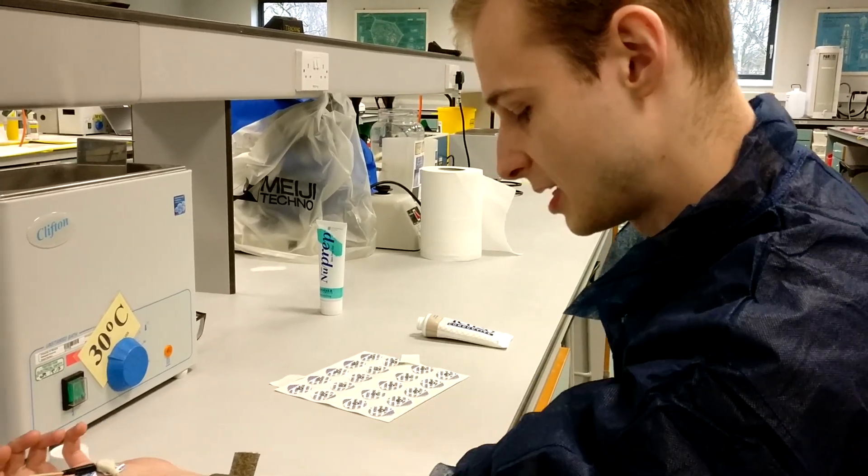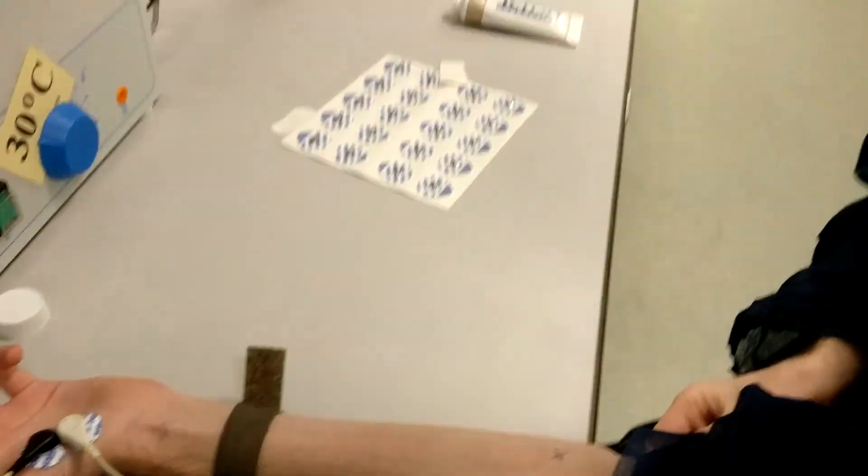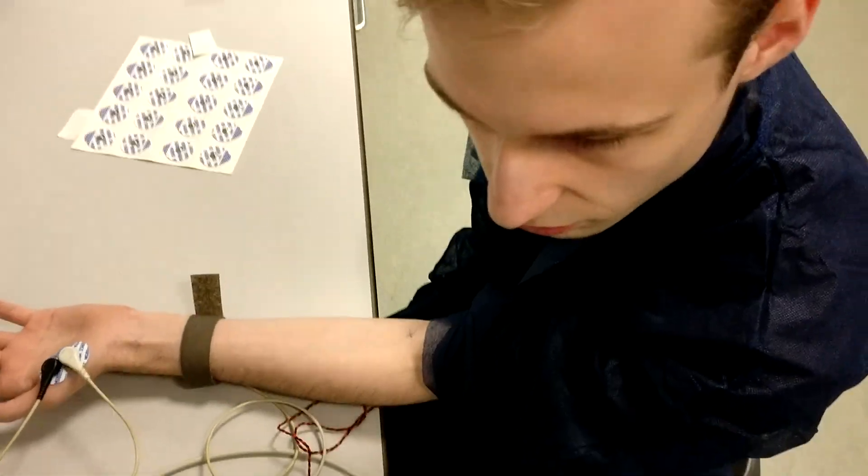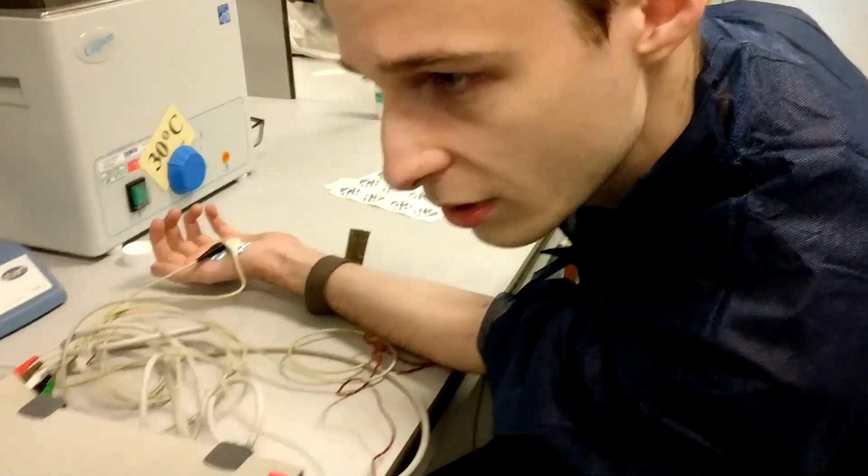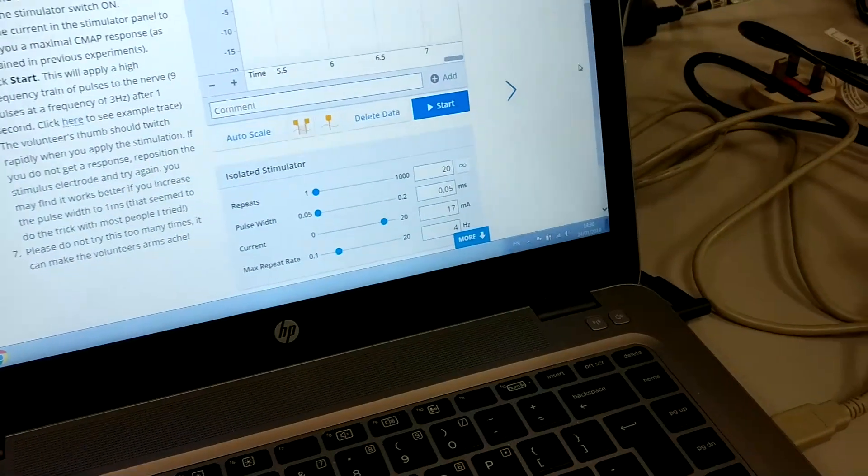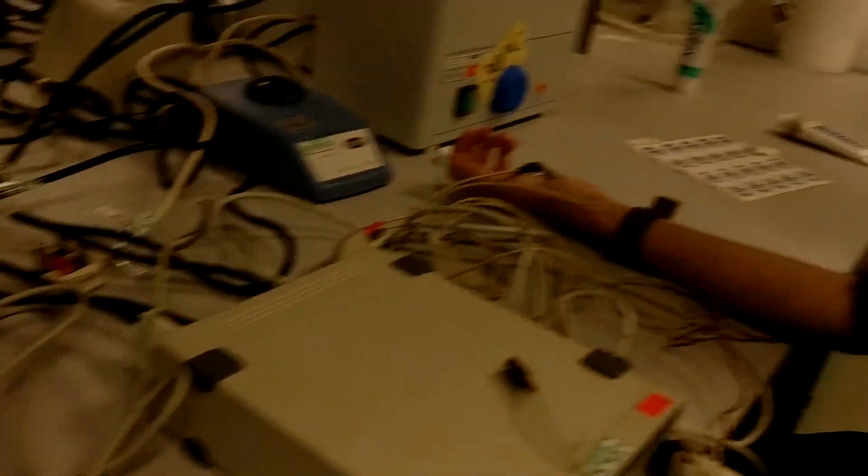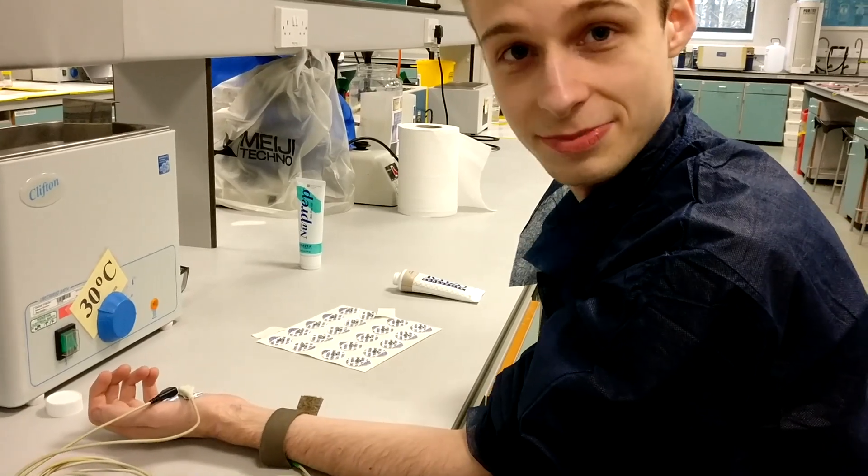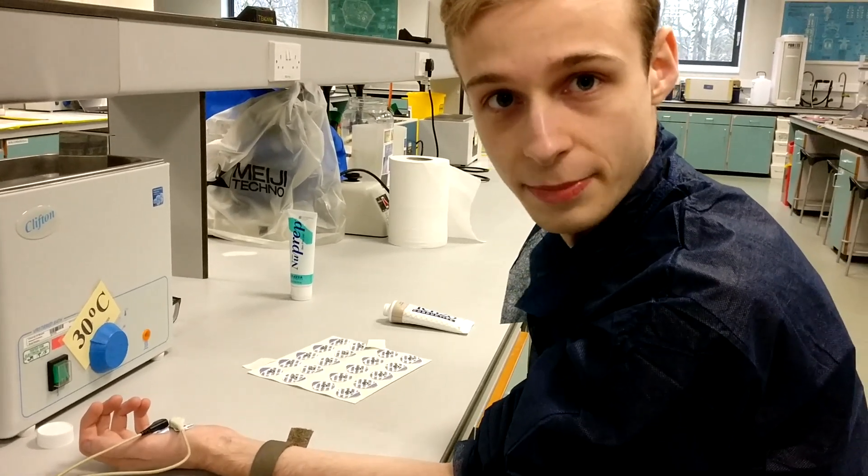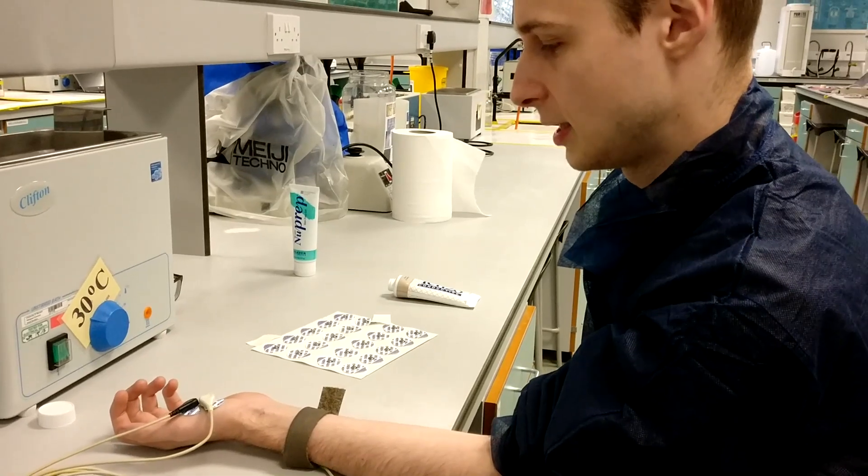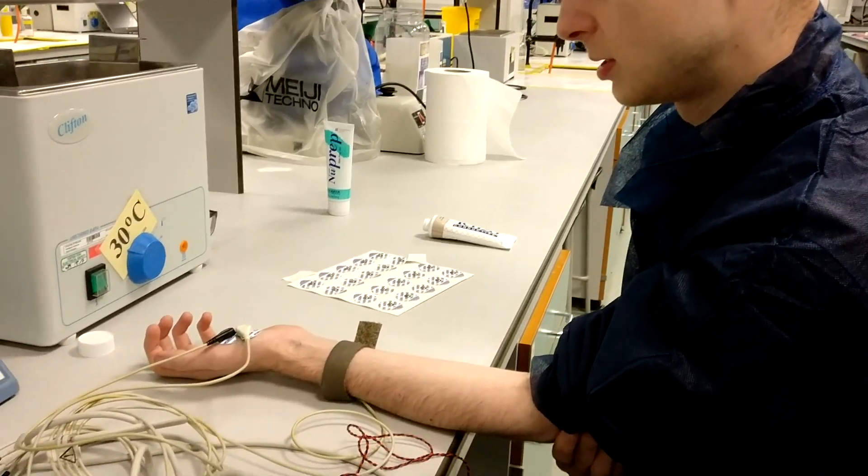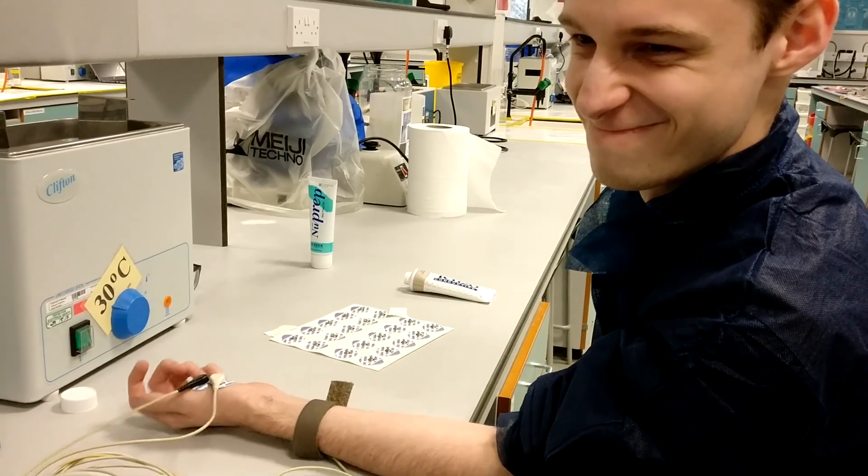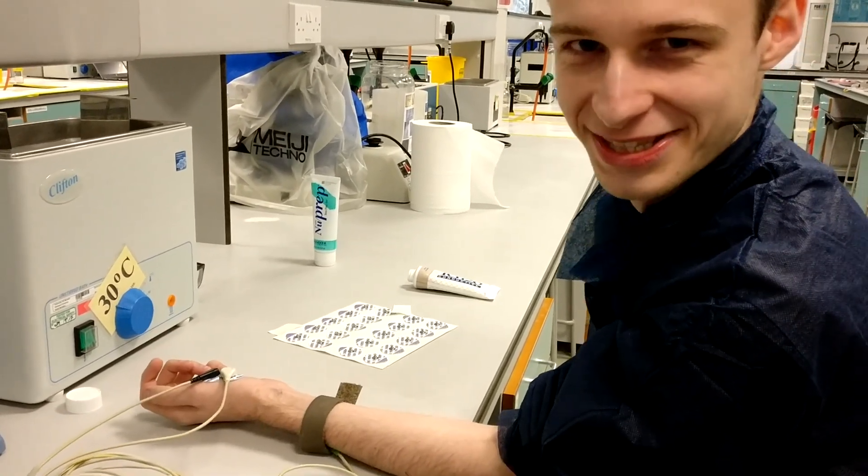I'm going to place this behind the point of my elbow so I can hit my ulnar nerve again. This time we're running at a frequency of four hertz, which is apparently—and I trust the lecturer that told us—the same rate as a benign essential tremor. If you look at my hand here, this is four hertz. It's such an uncomfortable sensation.